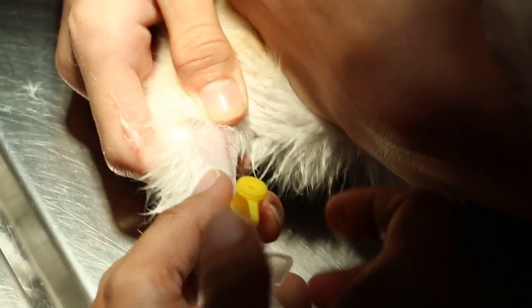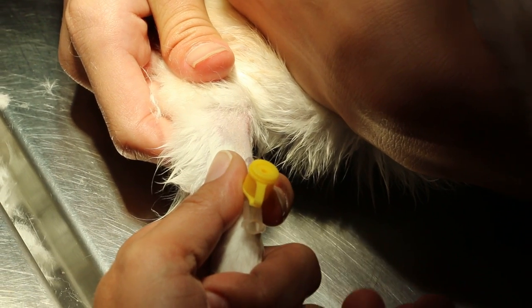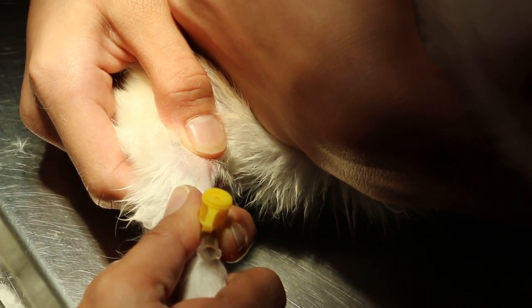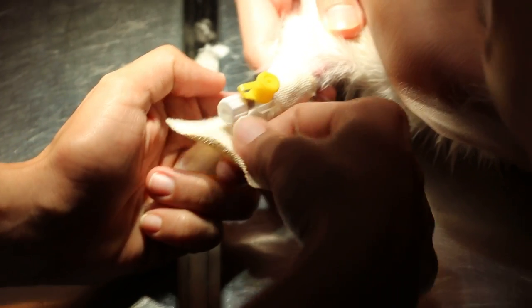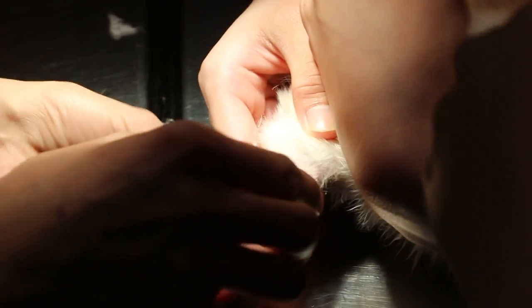Normally a very experienced person like Nash — they are very experienced. Then she might want to tape it first. Tape it first, press. Then she tapes it first. So this is successful — it's in. She tapes the catheter so that it doesn't fall off while we give the IV.